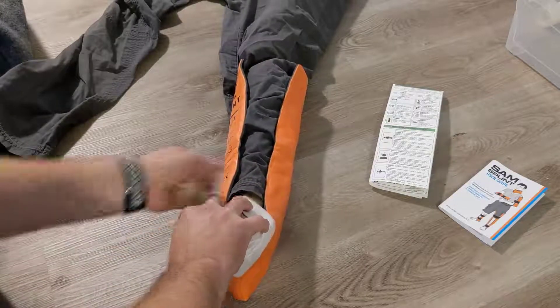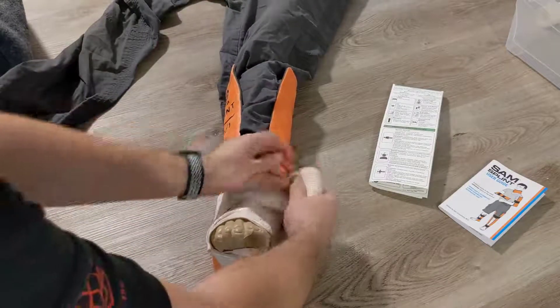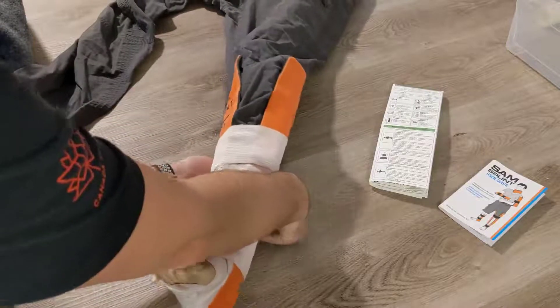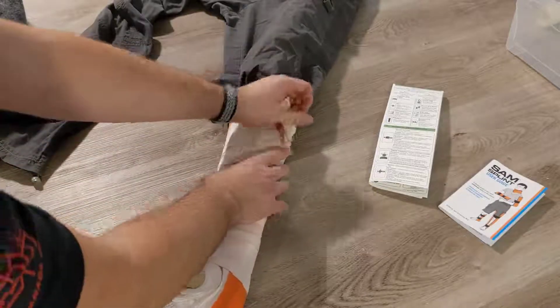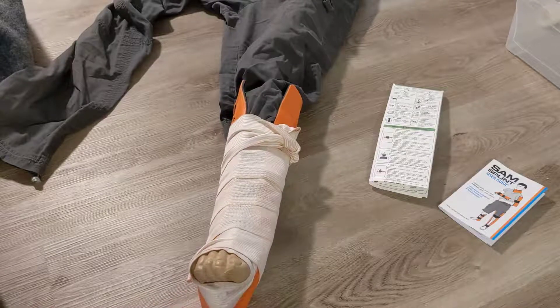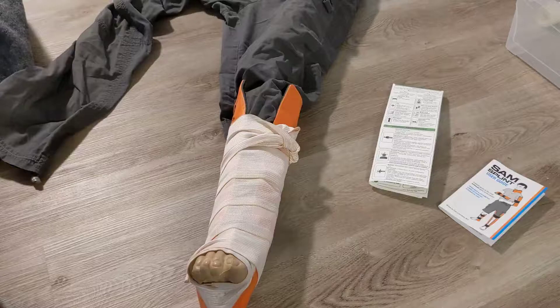Go around the foot first to secure the bottom, then keep wrapping upward. You want to keep it snug but not overly tight, and continue going up until the splint is secured. At the top, use clips, tape, or the tuck technique. That's going to secure the ankle well and immobilize it from further injury, then you can assist the patient in walking so they're not putting any weight on that leg.